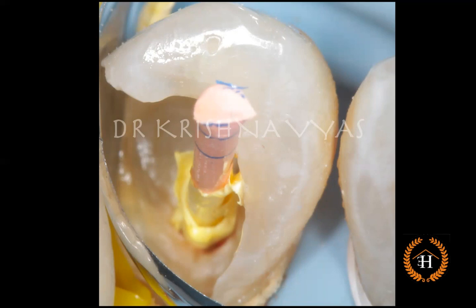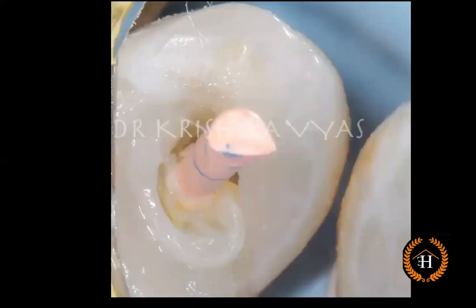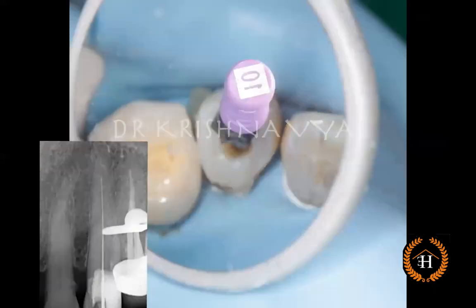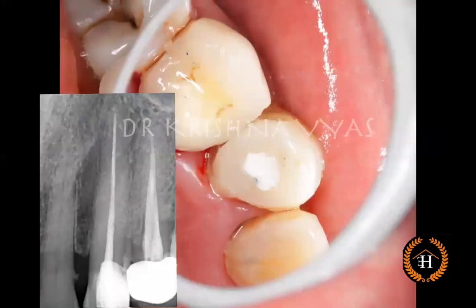The composite buildup was then done. The length of the gutta-percha was reduced to provide sufficient, easy working space. After the composite buildup, lateral movements are used to pull out the gutta-percha — it comes out easily along with the Teflon tape. Now we have a patent canal, working length determination is done, and we have standard reference points because we have built up the tooth. In the same visit, obturation was completed. This tooth had almost 31 millimeters of working length, and the next visit was appointed for the post-endo core.